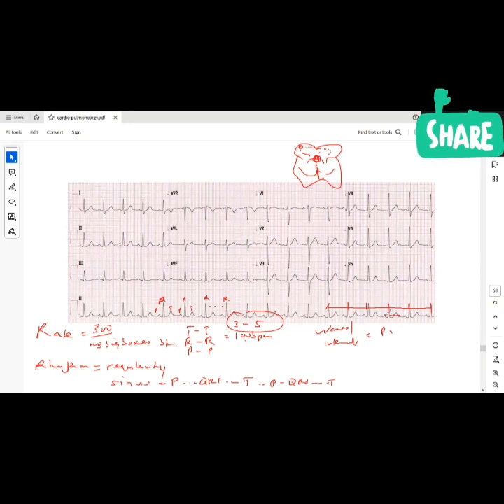So imagine if I give you somebody that has a P wave that's as tall as the T wave or even taller. That's an abnormal P wave. It means that the atrium is enlarged, it's thicker, it's bigger. Or the P wave, instead of being a single wave, is a double wave, right? That's also abnormal. Hypertrophy as well, or dilation of the atria. So things like that, that's what you're looking for.